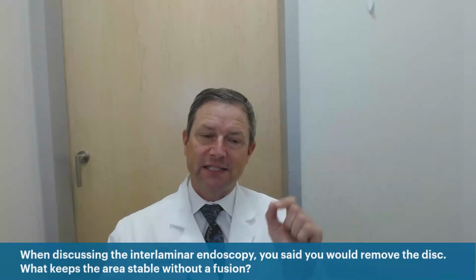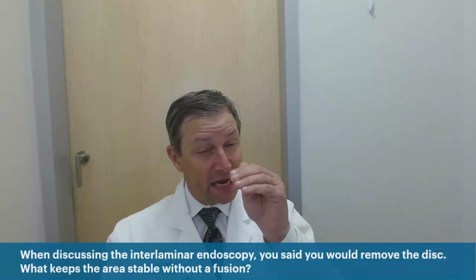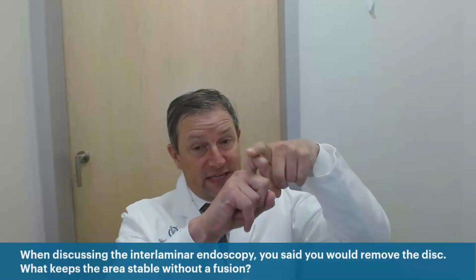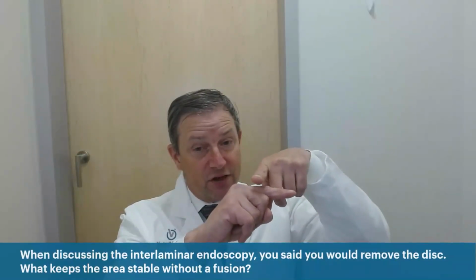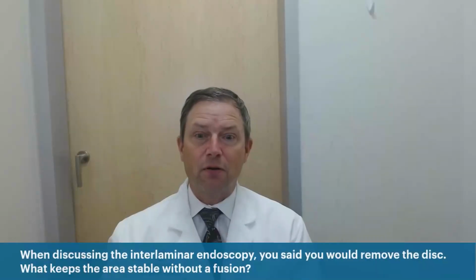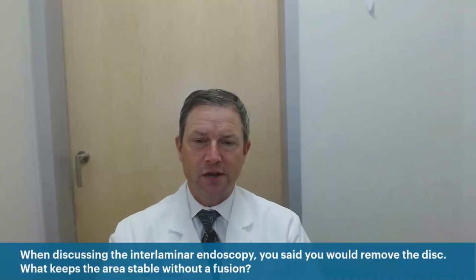You're taking out the piece of disc that's irritating the nerve. With the endoscope, I can see how that nerve lays in its native canal by flipping the scope around and looking at how it lays on top of the disc. Then as I remove that disc and get it out of the way, I can actually see that nerve start to float on the back because I'm looking down the back. So the endoscope is a very powerful tool to know that I don't have to take too much disc or too much bone and create instability. That's a great question. Thank you for that.